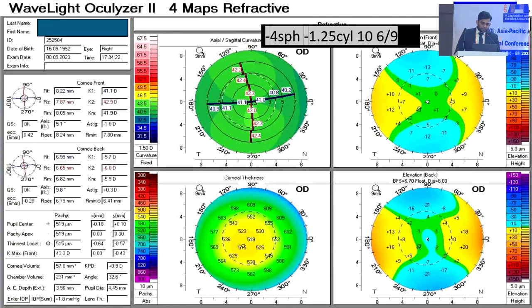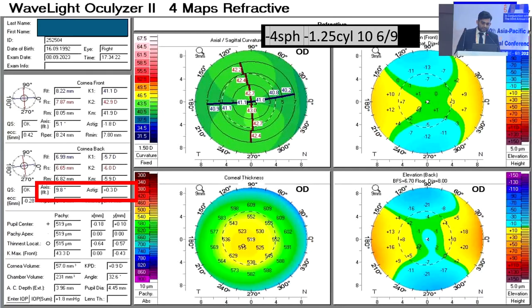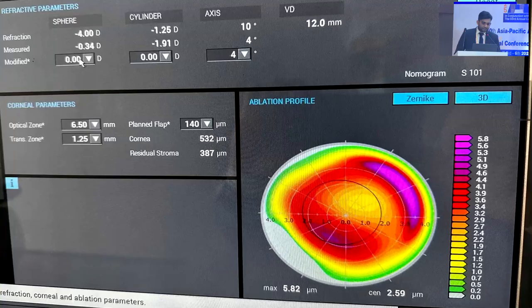So just to try to understand our approach here, let's look at an example of a 21-year-old girl with a refractive error of -4 sphere with -1.25 cylinder. Here the important point to take is the plus 0.3 posterior corneal astigmatism. We did a good Topolyzer scan. You can see the 3 ticks in the center. And now we got the measured astigmatism as -1.91.